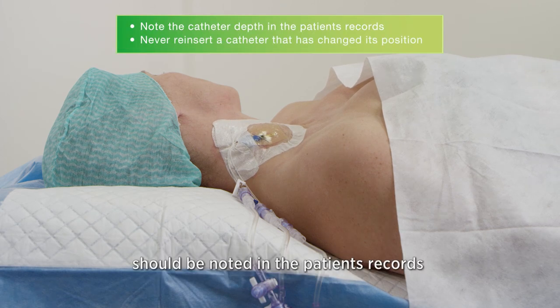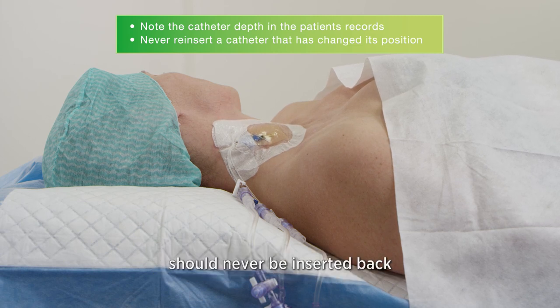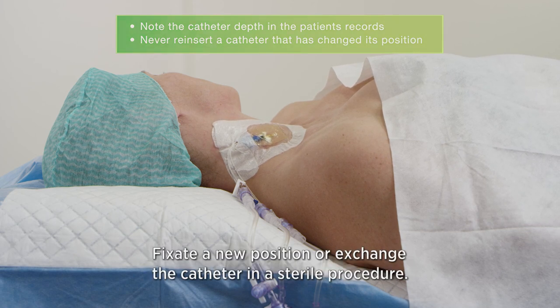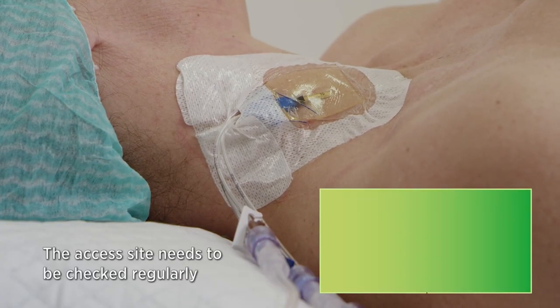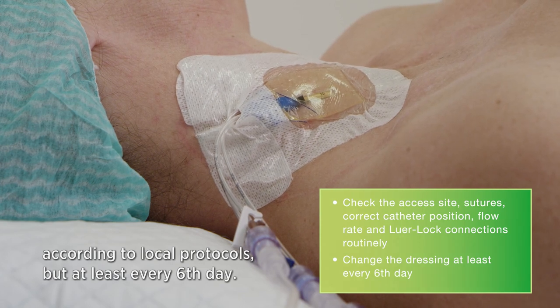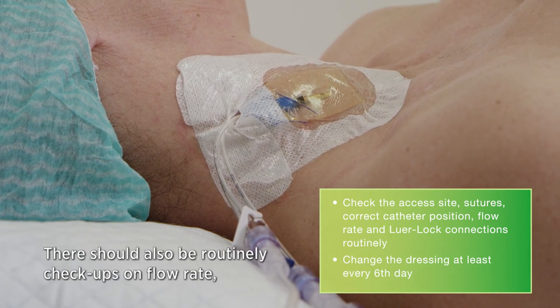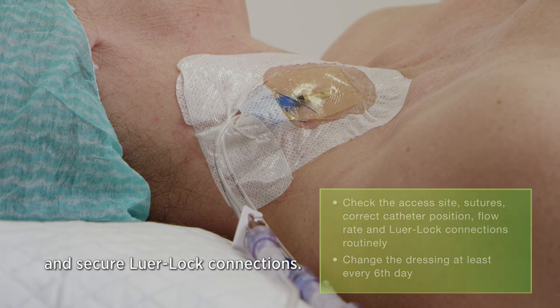The catheter depth should be noted in the patient's records in case of future catheter displacement. A catheter that has slightly changed position and slipped out despite the sutures should never be inserted back into its original position, as this increases the risk of infection. Fixate a new position or exchange the catheter using a sterile procedure. The access site needs to be checked regularly and the dressing should be changed with antiseptic technique according to local protocols, but at least every sixth day. There should also be routine check-ups on flow rate, sutures, correct position, and secure luer lock connections.